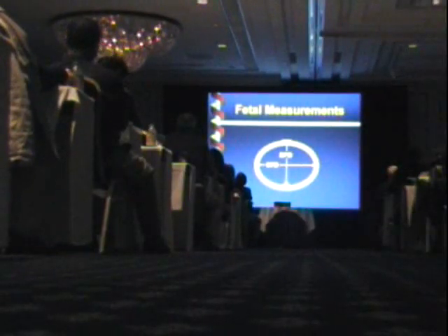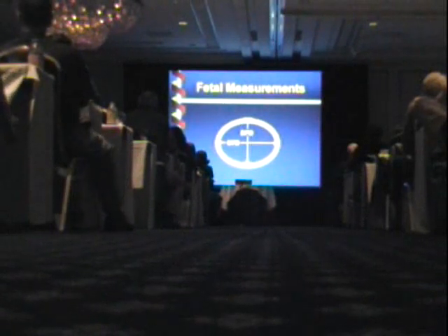On fetal growth and measurements. I have 15 minutes, and it's a topic that I could certainly go on about for an hour or two, about fetal measurements. We could probably put you to sleep, but 15 minutes is going to be a little tight.